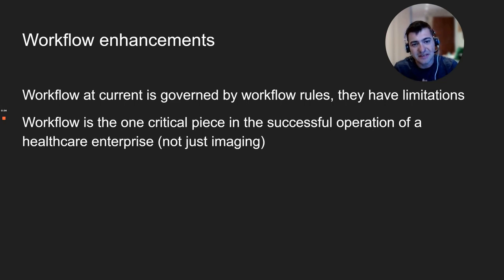Now, we need to consider another thing. In the previous video, we talked about triaging, and that can be considered a workflow enhancement. But I am talking about something slightly more immersed into the world of workflow, if you will. So we're talking about which is the next best, most available specialist that we can find to read one or another study. How can we route the study best?